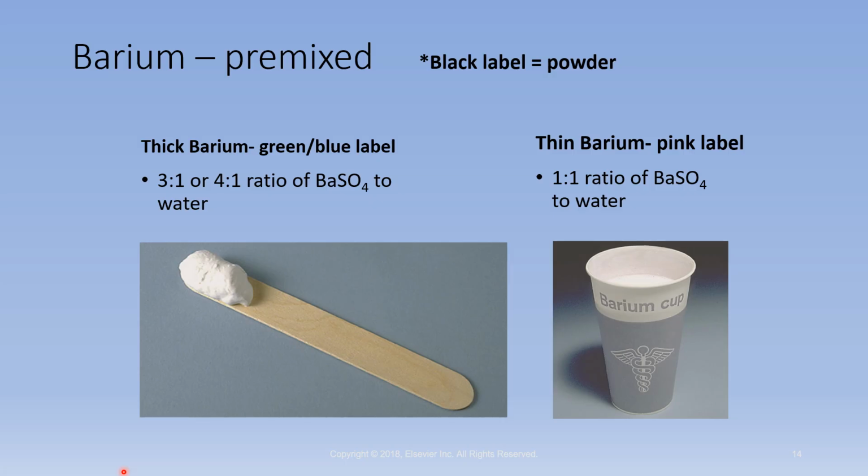And what they do is there's no images done, but they record the entire procedure, and they give the patient different consistencies of barium. So on 12.49 in the 11th edition, page 473, you can see they've got all the way to the right, there's a green bottle of thin liquid. There is Veribar nectar with the pink label. Then they've got the pudding on there that's a thick paste. And then the one all the way to the left says Veribar honey. So those, think about it, those consistencies.